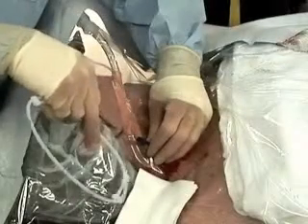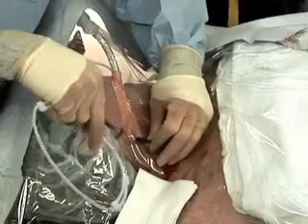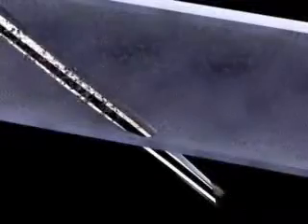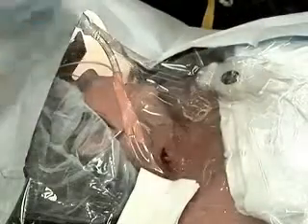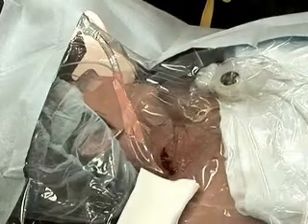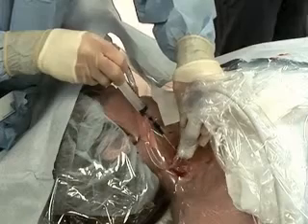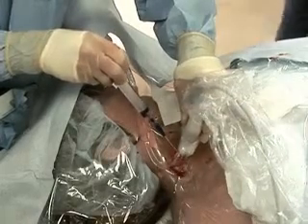If the wire will not thread through the needle, you may need to adjust the placement of the needle, since it may have inadvertently been advanced during manipulation. If so, adjust the needle and reaspirate to be sure that you are still within the vessel. If you are unable to reestablish blood flow, remove the needle and start over. If the vein has been difficult to cannulate, the presence of a clot in the needle will further complicate assessment of whether the vein has been successfully entered.